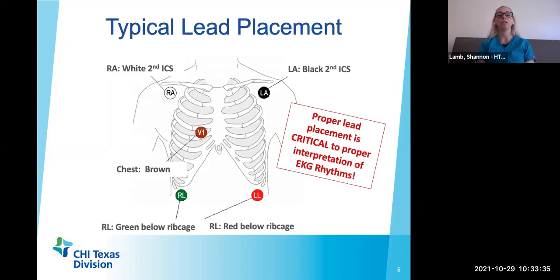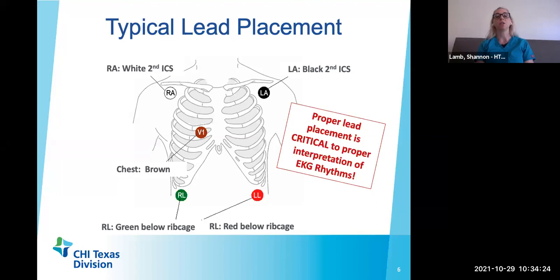There's typical lead placement for our five-lead EKGs. We have five leads: the right arm which is white, the right leg which is green — we say sky over grass. The left arm is black and the left leg is red — we say there's smoke over fire. We also have a V-lead and the V-lead is brown — I like to say that chocolate goes close to your heart. If your patient has not had any type of surgical procedure such as a sternotomy or open heart surgery, we can place the V-lead generally in V-1. If they have had a sternotomy, we wouldn't want to place that lead around their incision because it could cause infection, so we would move that lead into the V-6 position, which is on the left side of the rib cage in the mid-axillary line.